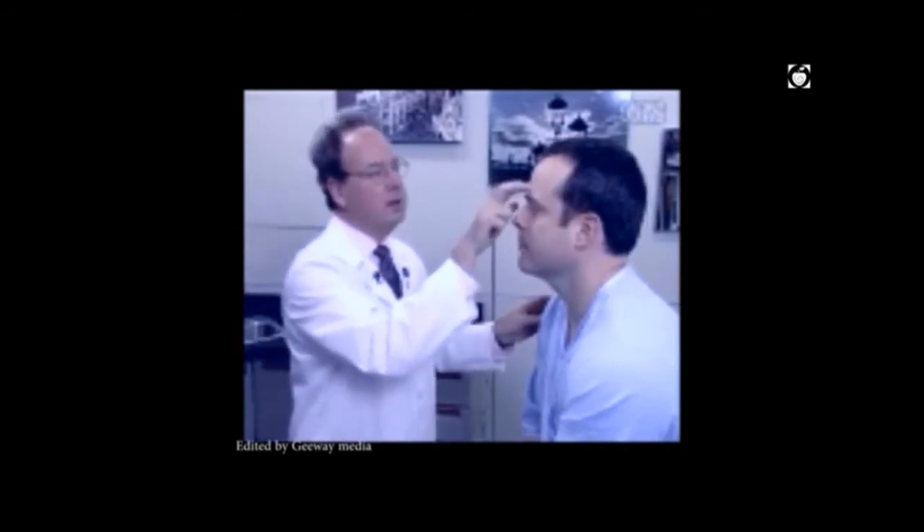Next, inspect the nose and nasal skeleton as well as the sinuses. Palpate the frontal, maxillary, and ethmoid sinuses for tenderness. Evaluation of the nose is done by having the person extend the neck, using a light source, and elevating the tip of the nose.